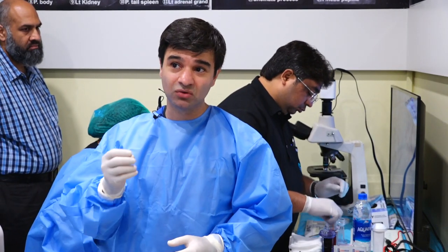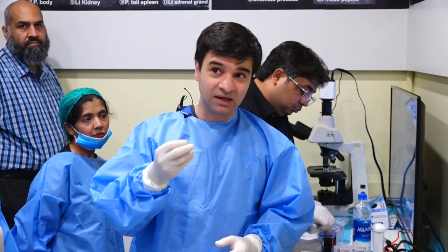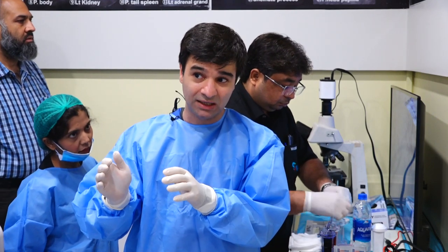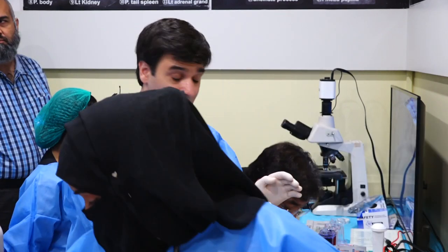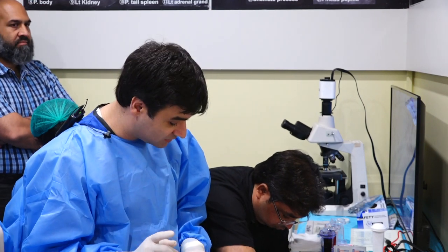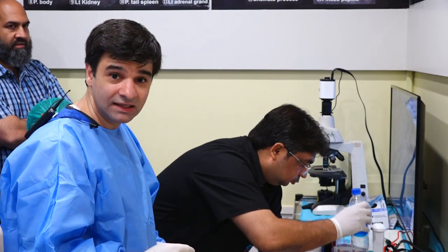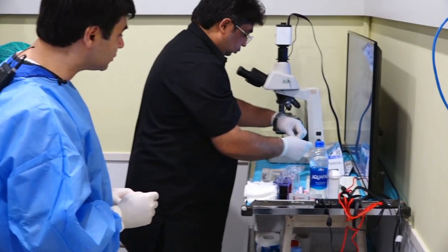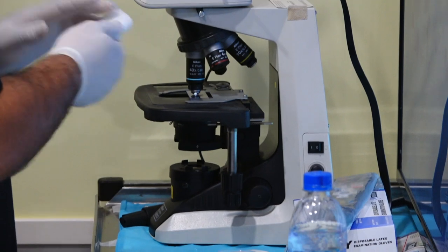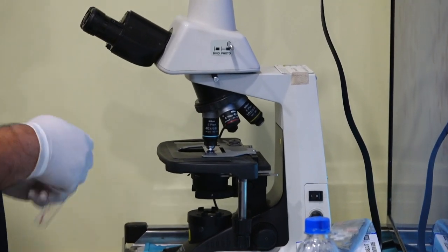If you have the ability to have a pathologist or a cytopathologist look at the slide, that is helpful. But if you don't, having an understanding of the basic interpretation of what we call a spindle cell tumor, which this could be or most likely is, versus something like a neuroendocrine tumor or a lymphoma is going to be very helpful. Now, I'm not an expert at pathology, but Dr. Hassan is. So what I'm going to do is put the slides under the microscope, and we're going to evaluate what the cells look like and answer the basic question of adequacy and whether or not we need ancillary staining.